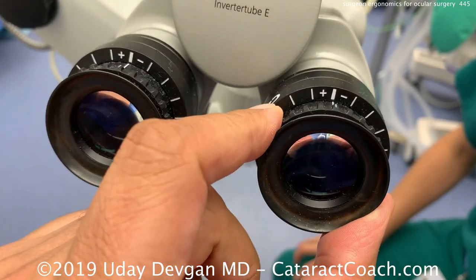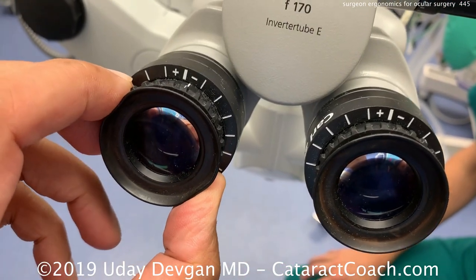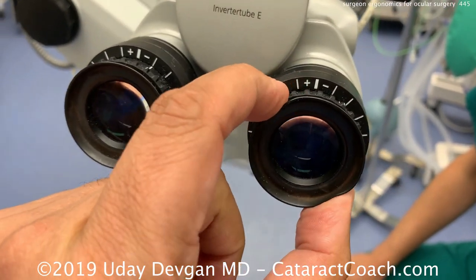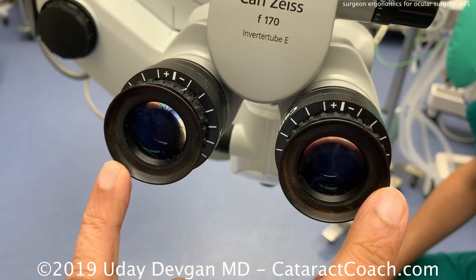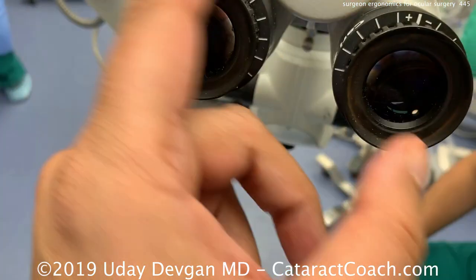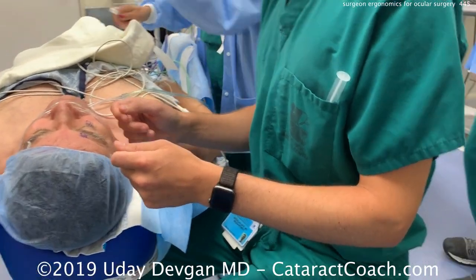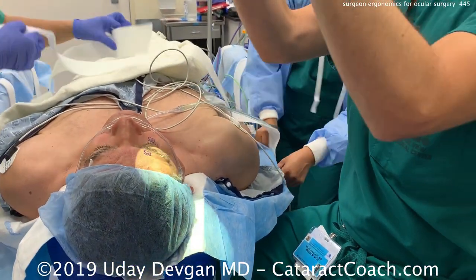Now look at the oculars — you need to dial in your appropriate prescription. If both eyes have the same prescription, set both oculars to zero. An emmetropic surgeon should have it at zero on both. If you have a little myopia, you may want to dial that in — a little more myopia on the right ocular, a little less on the left. The key is to have it dialed in so that you are in perfect focus on the eye at the same time the camera is in perfect focus. If you're a young surgeon who tends to accommodate too much, dial in a little minus to help absorb that.